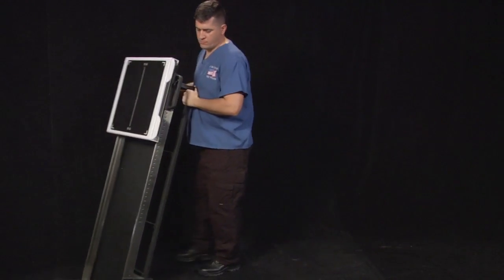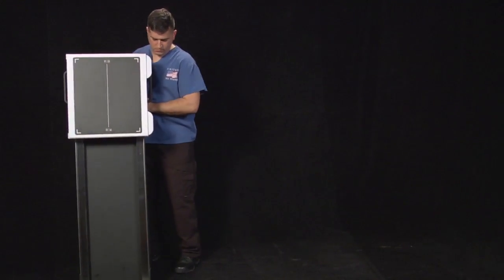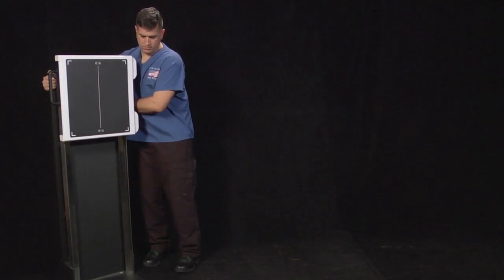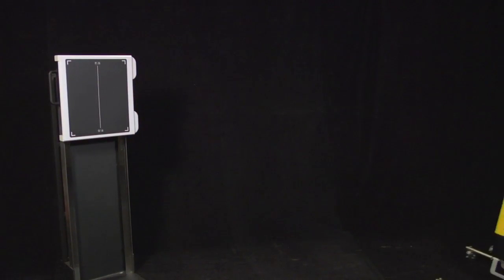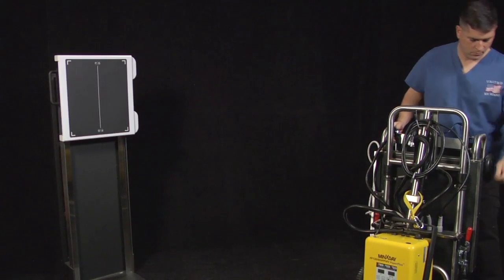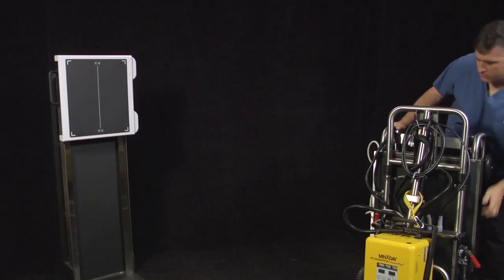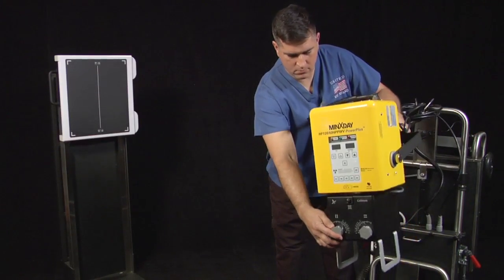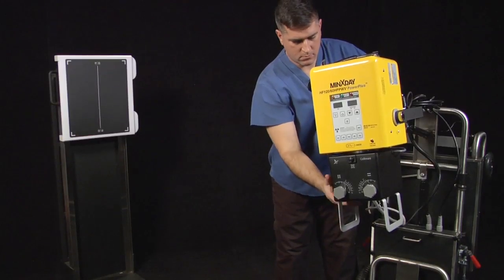Set up the Rayna upright cassette holder and position the Min X-Ray HF120 in front of the cassette holder. Plug in the power cord from the X-Ray unit and turn on the X-Ray power switch located on top of the tube head. Raise and rotate the tube head up and facing the upright cassette holder.